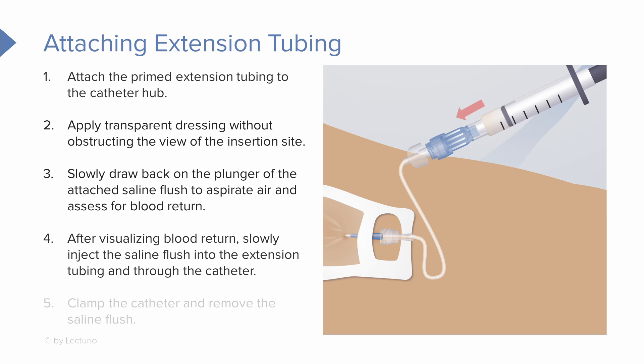Now after visualizing blood return, slowly inject the saline flush into the extension tubing and through the catheter. Then clamp the catheter and remove the saline flush.